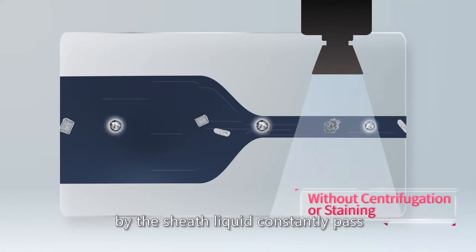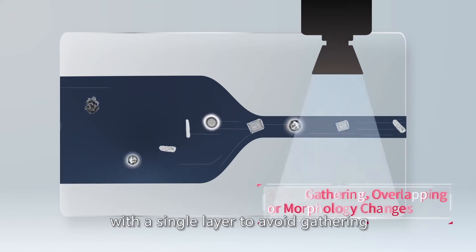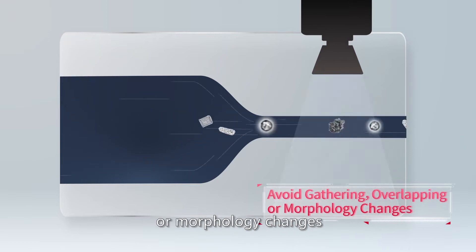The urine-formed elements directed by the sheath liquid constantly pass through the flow cell with a single layer to avoid gathering, overlapping, or morphology changes.